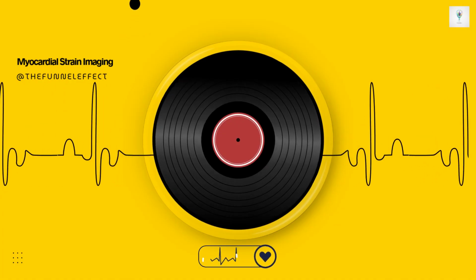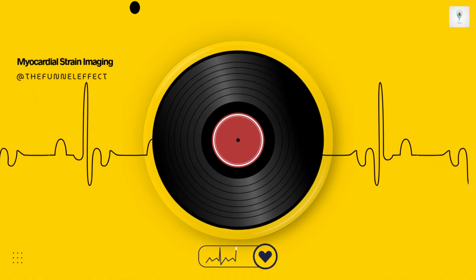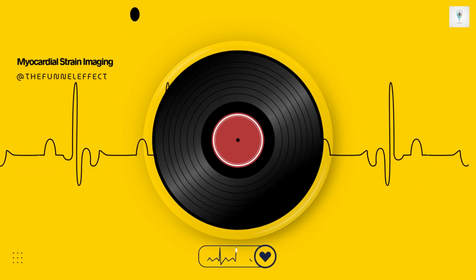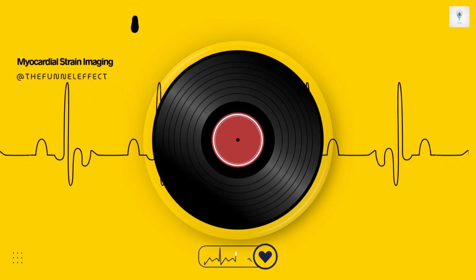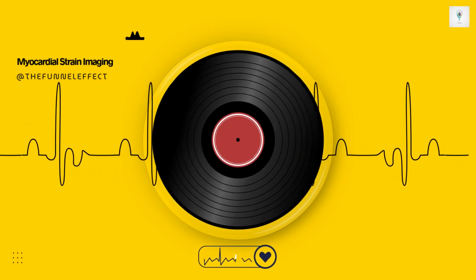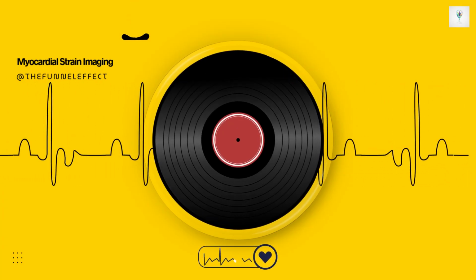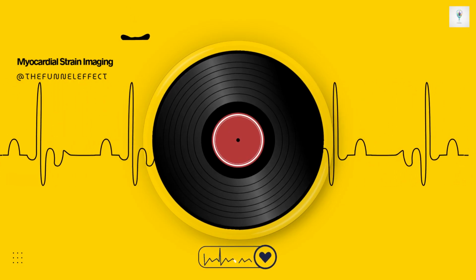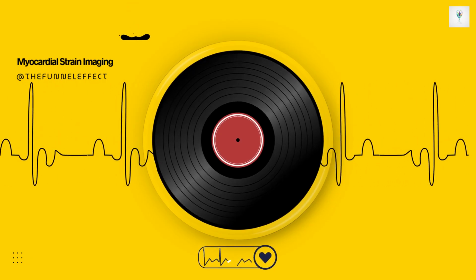Why just the free wall? Partly because its motion is predominantly longitudinal, and partly because clinically the free wall strain often has a larger absolute magnitude, maybe by about 5 strain units compared to the global RV strain, which includes the septum. This larger value might make it a bit easier to detect changes. Is there a cutoff for normal RV free wall strain? The data suggests that an absolute RV free wall strain value less than 20%, with some guidelines saying 18% or 15%, is highly likely to be abnormal or pathological.